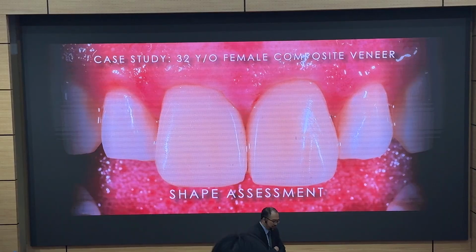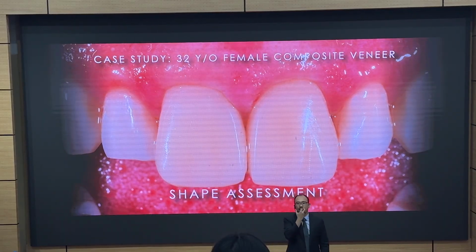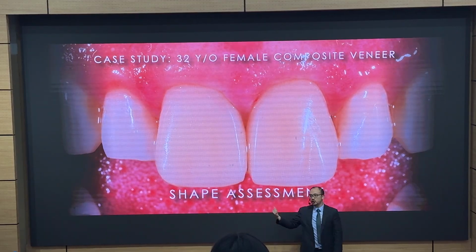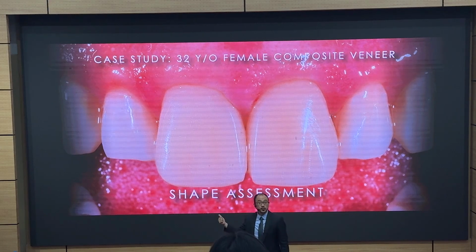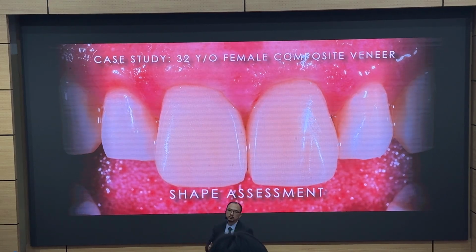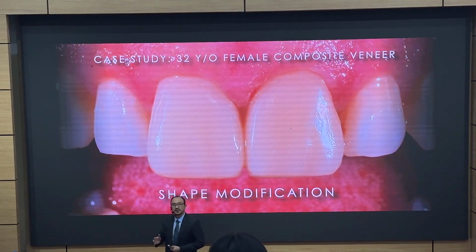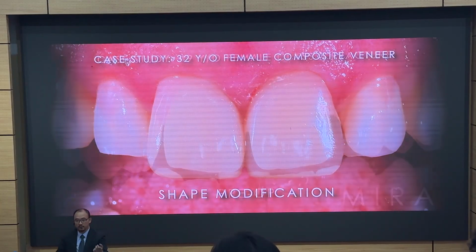One of the downsides for this BRB technique is that patients don't get to see what the end result looks like beforehand. Okay? So when she had a little look at this, when everything is done, she would say, "Doctor, it looks very good, but I feel that it's too long." That's okay. Then you just go ahead and adjust the edge. So this is one of the limitations of the BRB technique, but still very, very helpful.